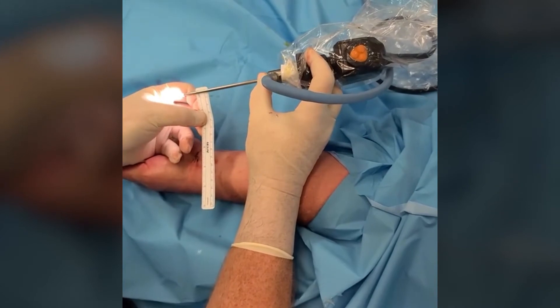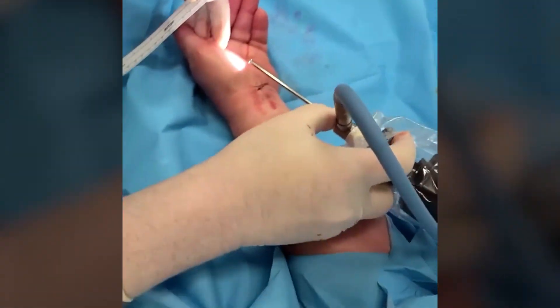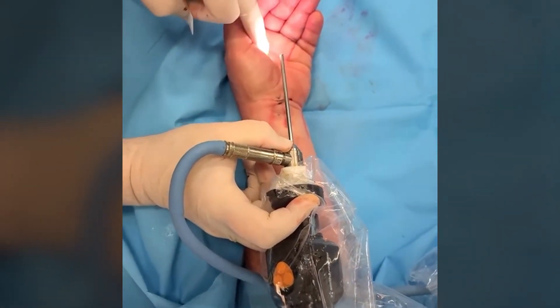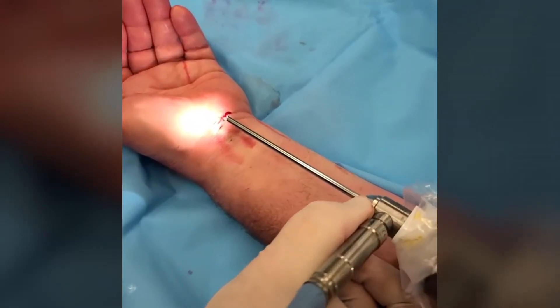It's about three and a half to four millimeters big, and this scope is what goes inside up to approximately the middle of the hand when we release the ligament. Then one or two stitches and the surgery is done. The whole thing lasts about five to ten minutes.